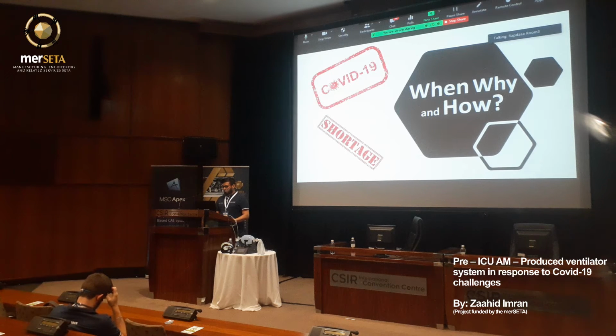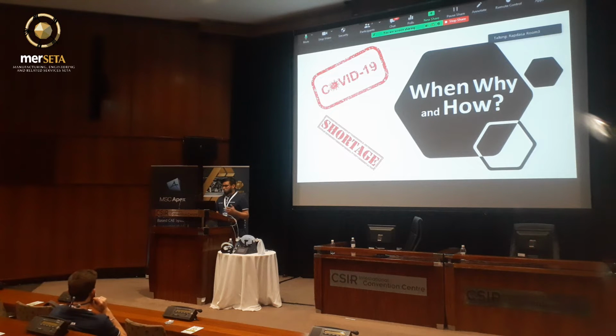Our ventilator is derived from MIT's open source ventilator platform that already meets the clinical requirements for a medical respiratory device. Automating the procedure for compression seems to be the simplest strategy to satisfy the need for low-cost mechanical ventilation, with the ability to also be easily and cost-effectively manufactured at scale. Producing this via local additive manufacturing resources is obviously cheaper than importing a conventional ventilator from, let's say, the US.